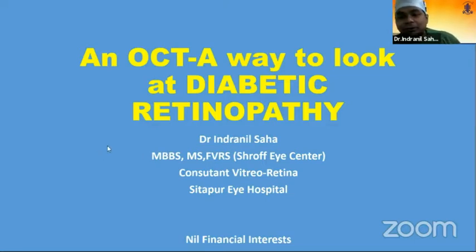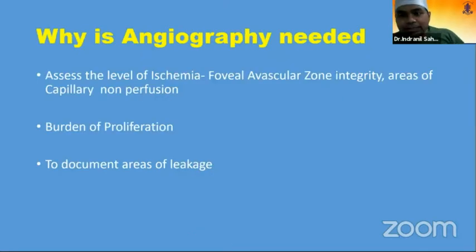So I will be talking about an OCT-A way to look at diabetic retinopathy, which is a very common case scenario in our OPDs. Are my slides visible? Yes, sir. Okay. So why is angiography needed?